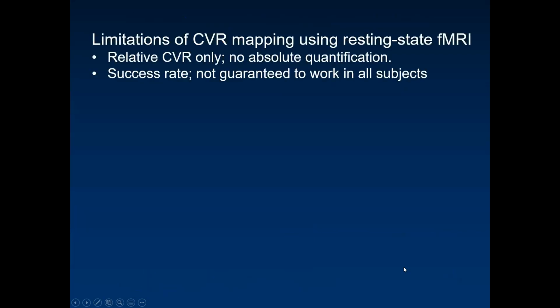So far I talked about the CVR mapping using pure resting state BOLD. However, there are some limitations of CVR mapping using just a resting state BOLD scan. It yields only relative CVR values when we are not using end-tidal CO2 as a regressor, so there's no absolute quantification.